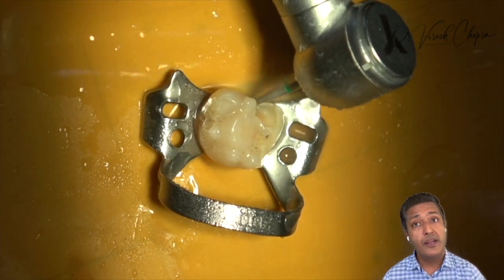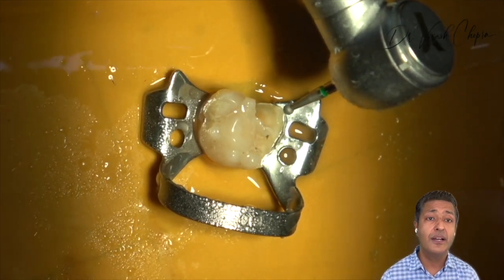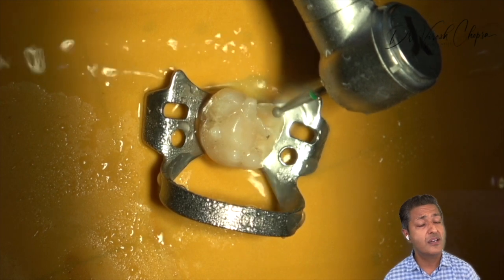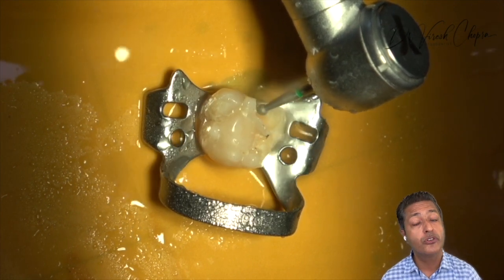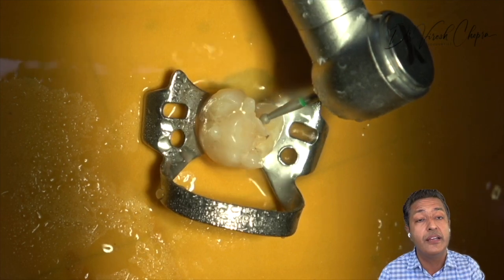Use a round burr as you can see on the screen, but do not put any pressure while doing excavation of this peripheral caries, because round burrs are working at a high speed. So we know that once we touch this round burr in motion on the tooth structure, it will cut the tooth. We don't need to create any pressure there.